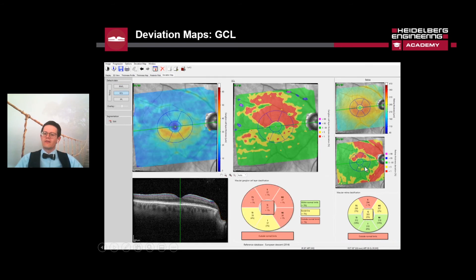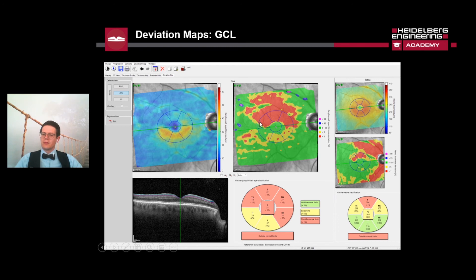However, the Garway-Heath sectors for the center of the macula are optimized for the ganglion cell layer, so we look at that next. We can see similar information: the inferior part of the ganglion cell layer shows yellow and red, while the top is mostly blue. In the deviation map, there is a high loss of ganglion cells on the superior part and a little less on the inferior part. The classification shows the same categorization as the deviation map tab.